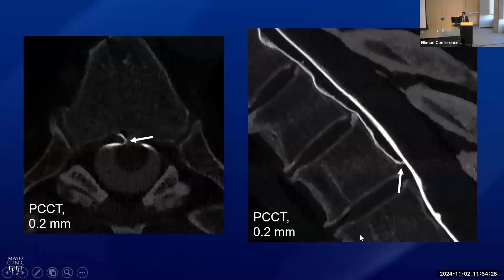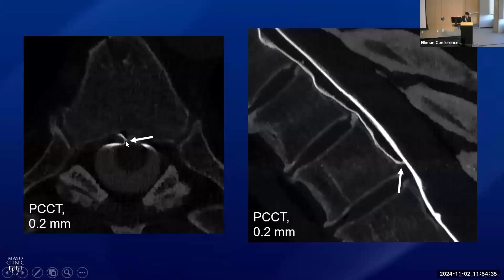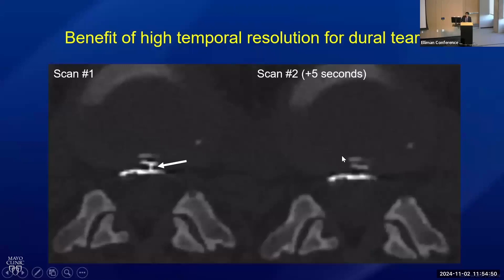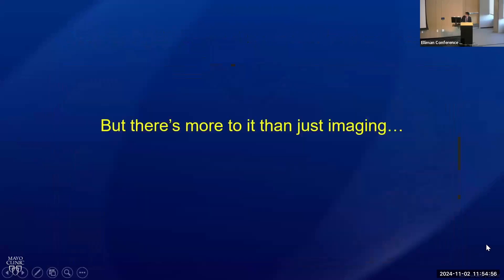I've started to do most of these on photon counting CT now, mostly because it helps our surgeons — they like to see with high resolution exactly where the leak is coming from, for example appreciating that it's a little bit off to the right of midline. Here's a case where temporal resolution really helped on photon counting CT — two scans from a prone dynamic CT myelogram. On the first you can see this ventral dural tear, and then just five seconds later you can no longer see the contrast flowing through that dural tear. So it really helped us localize this leak accurately.